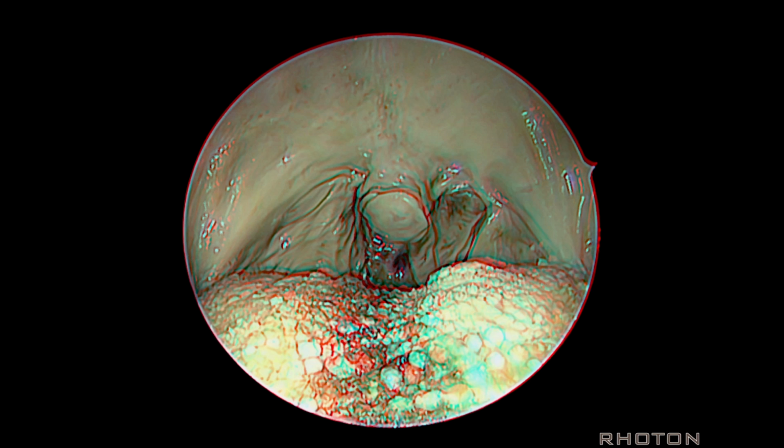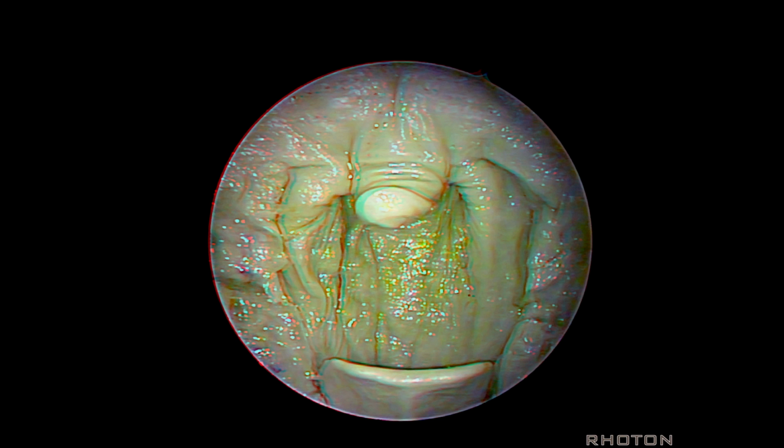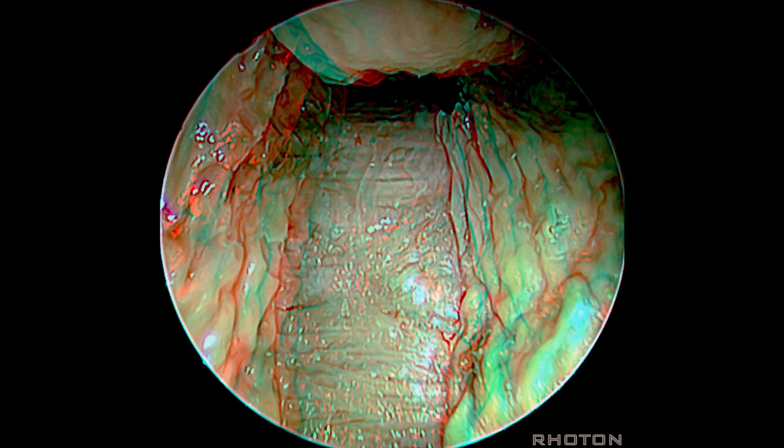Now we're coming transoral, and we're looking at the uvula. You advance the endoscope, you see the epiglottis, and you open transorally.